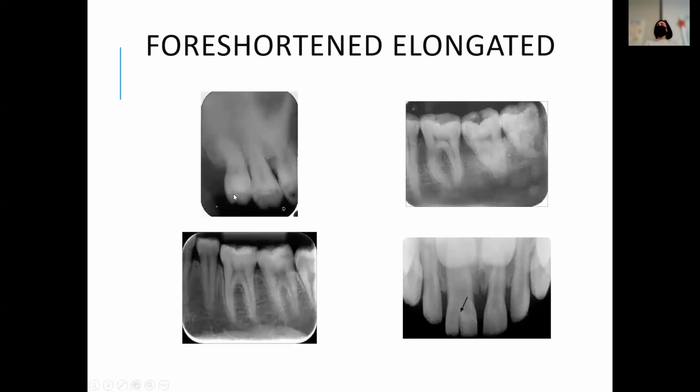Again, look at how the lingual cusps end up here, and then the buccal cusps look all dragged and stretched down. So look at the space here between where the cusps end and how they get dragged down over here. The cusps have a dragged out look, and then the roots end up looking kind of distorted and usually kind of short.